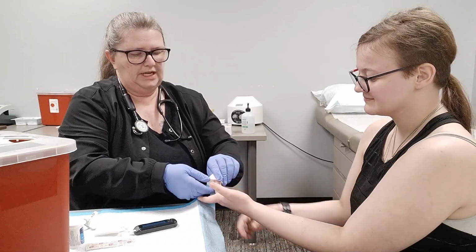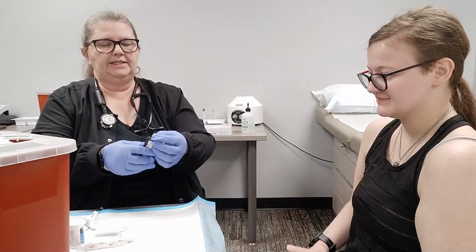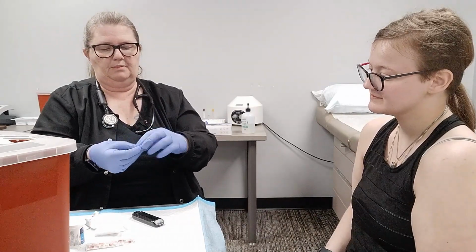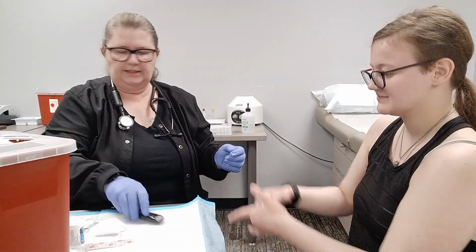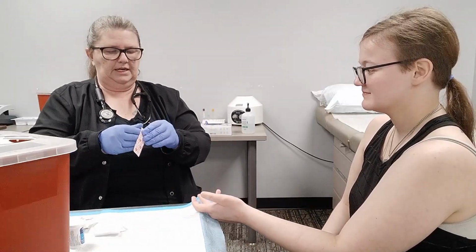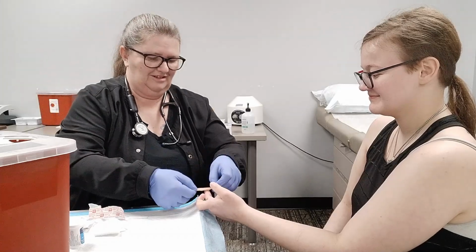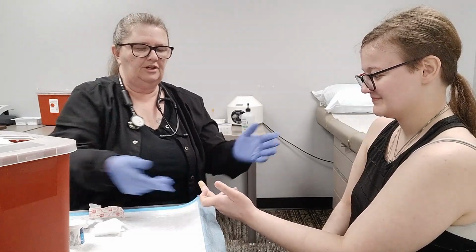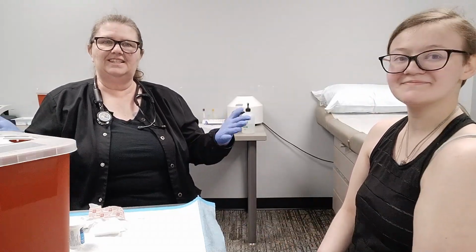Then we're going to make sure we take care of our patient here. Okay, a little more pressure just for a moment. I'm going to take my strip out, and since it has blood on it and I have blood on this, I'm just going to wrap them up together. We'll dispose of those in just a minute. All right. Okay, let's take a look-see. All right, perfect. We'll give her a little Band-Aid as a souvenir for being a brave soul. There we go. We will document that, report it to the provider, and see what they have to say and hopefully send her on her way. All right, that is it. Thank you so much.